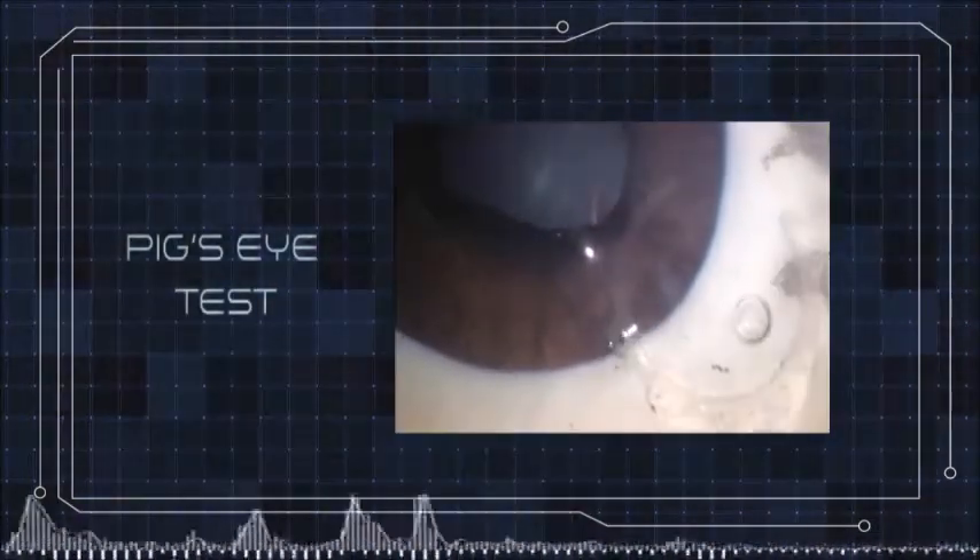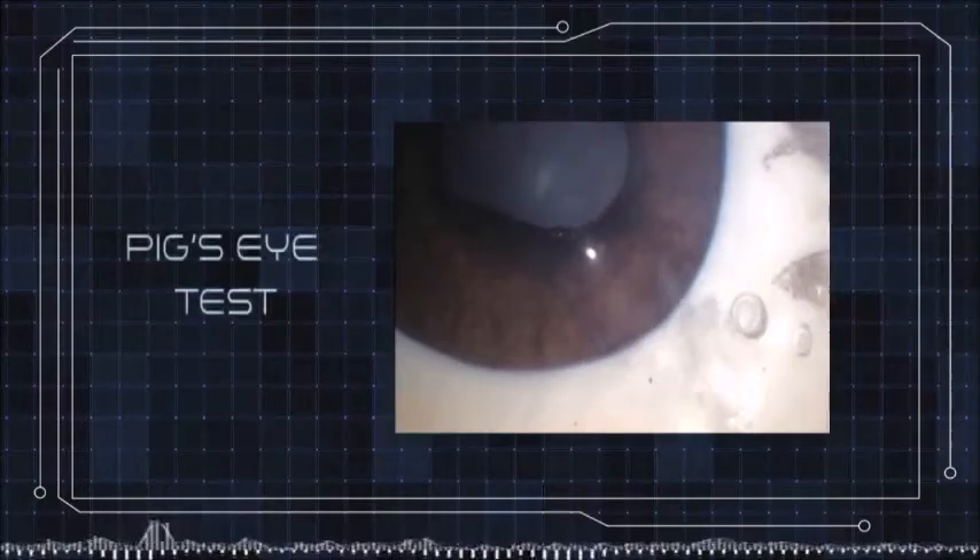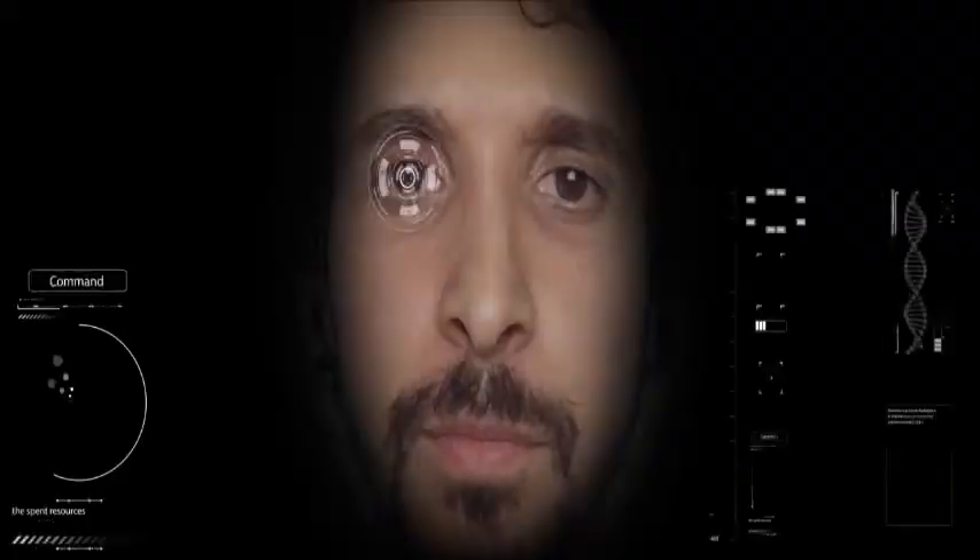The test in the pig's eye was perfect! Congratulations! Good test, Jarvis! Good test in the pig's eye!